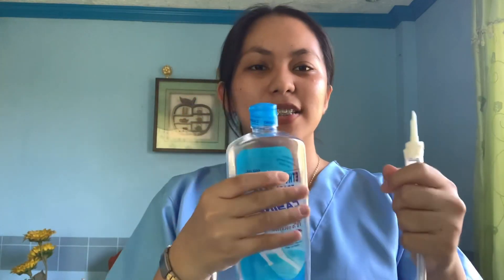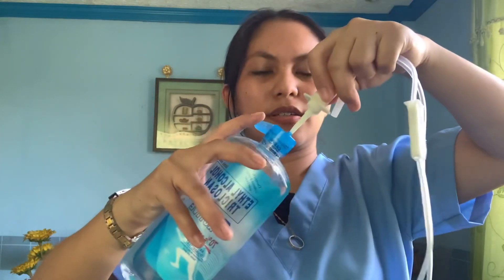Imagine that I already washed my hands. What we're going to do is open the IV infusion set — imagine that I have sterile gloves. I'm going to open it like so. This is the IV infusion set; this is where we are going to insert the bag or the IV fluid. First, we're going to remove the cap — make sure not to touch the spike where we're going to insert the fluid. Next, we're going to open the IV fluid — let's imagine that this is an IV fluid. Imagine that I spiked it and insert the spike like this.